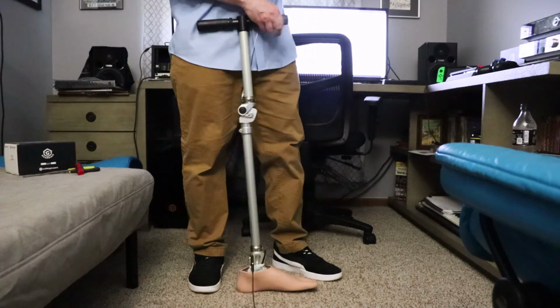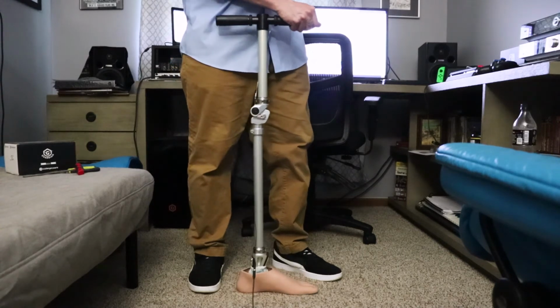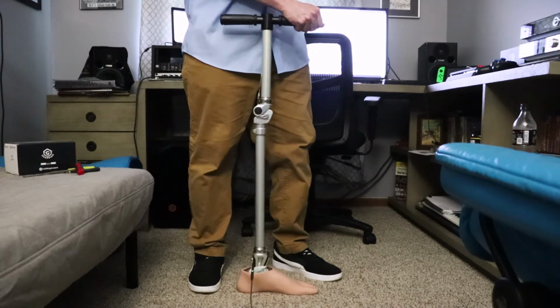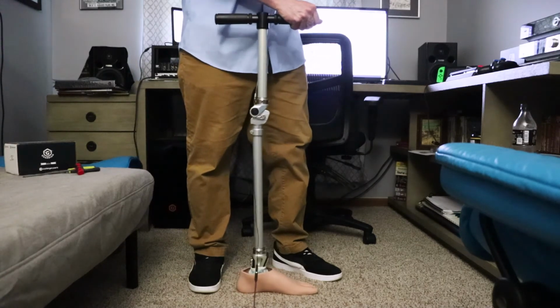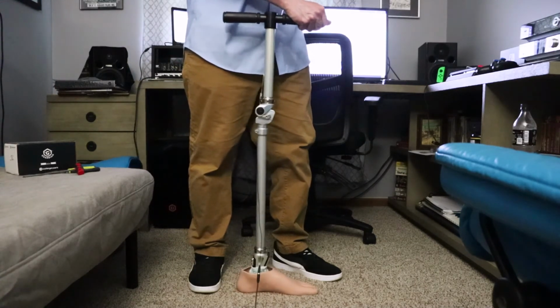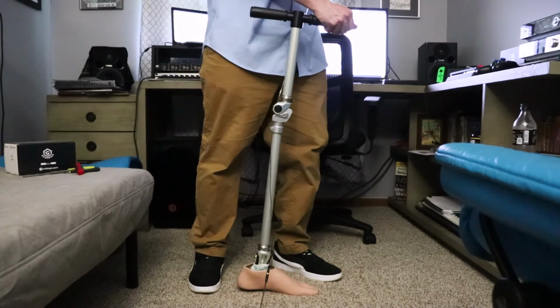Now if you're doing all those things and it's still difficult to unlock the knee, it could be the stance flexion adjustment. So you may want to take a look at that. If you've taken the stance flexion out of the knee, you may need to introduce more stance flexion back into the knee. So let me show you what I mean.